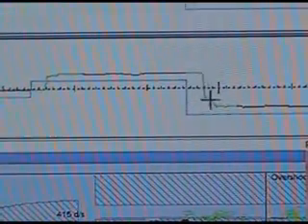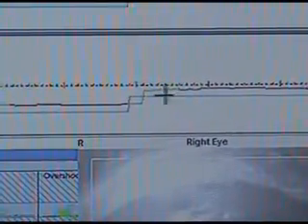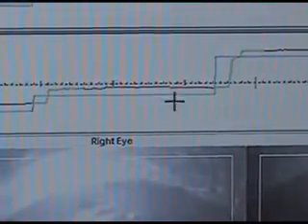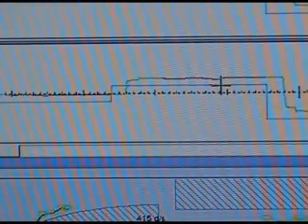And then as you can see to the left again, he undershoots the target. And he does pretty good here going up, which is to the right, and then a little bit of an undershoot through here. So again, that's an example of undershoot, but he's fairly stable between the saccades. As he's stopping on the dot that he's looking at, he doesn't bounce around very much. So that's a good sign there.